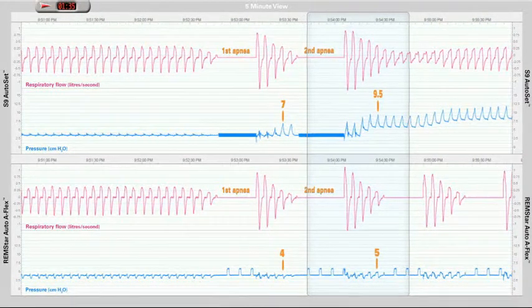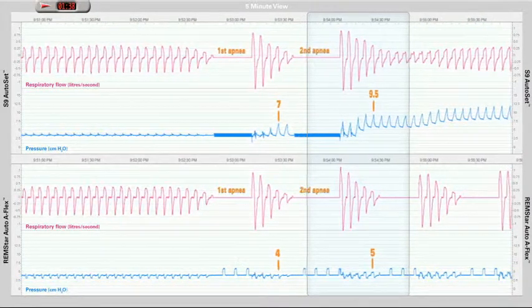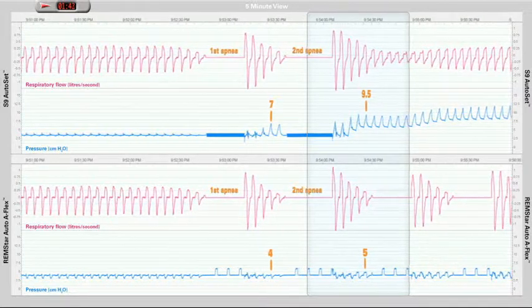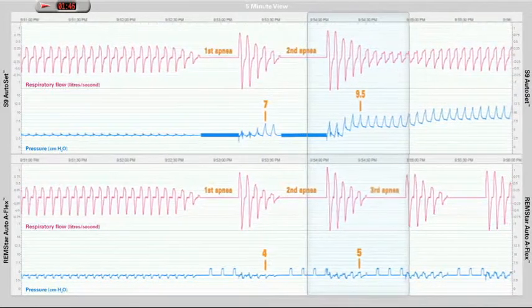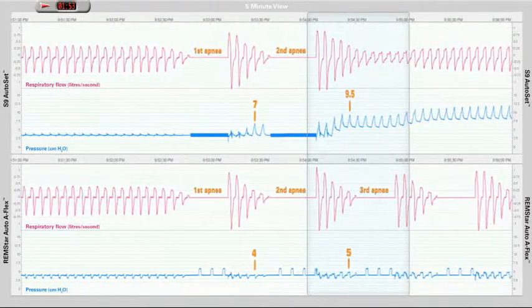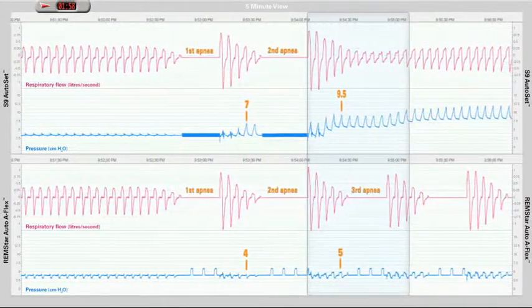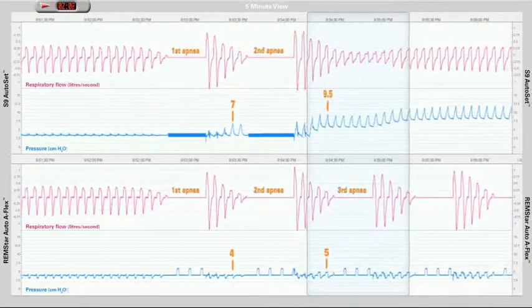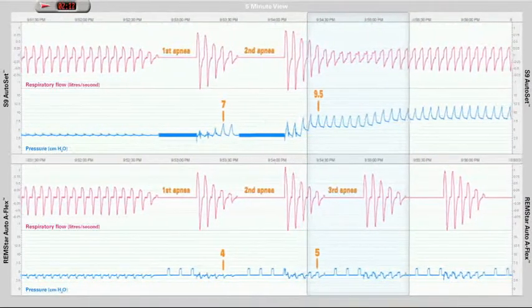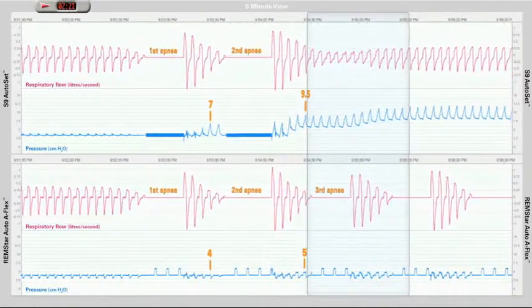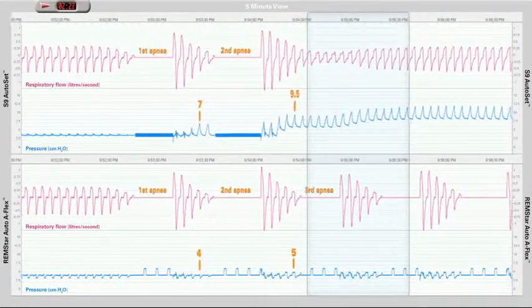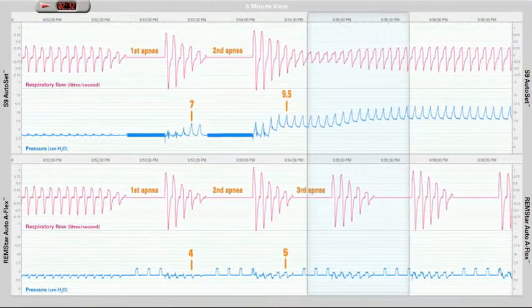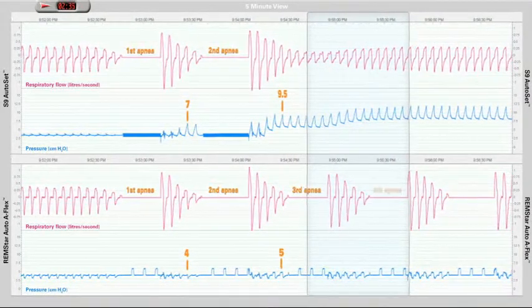This pressure increase is not enough to prevent the Remstar Auto patient experiencing a third apnea. The S9 Autoset detects there is evidence of slight flow limitation in the breath shape and increases the treatment pressure to prevent further apneas and flow limitation. We now see the S9 patient has achieved normal rounded breaths, while the Remstar Auto patient suffers a fourth apnea.